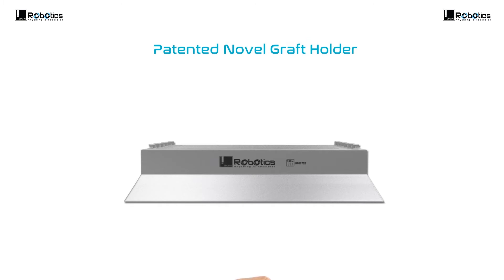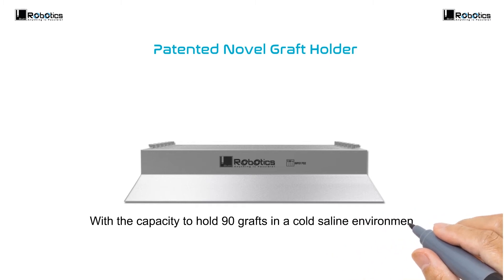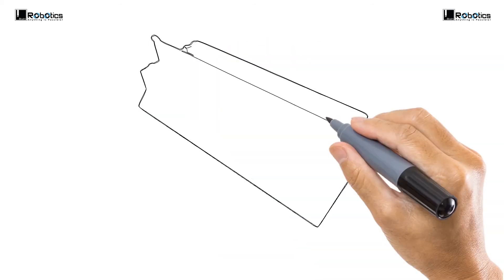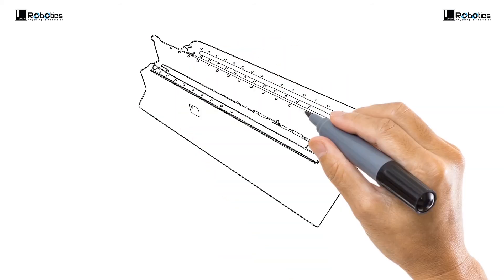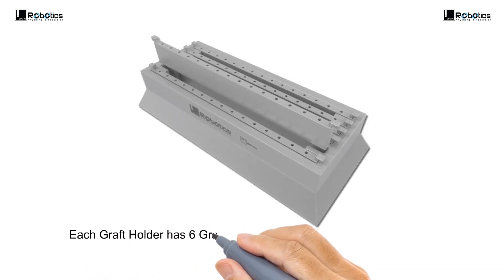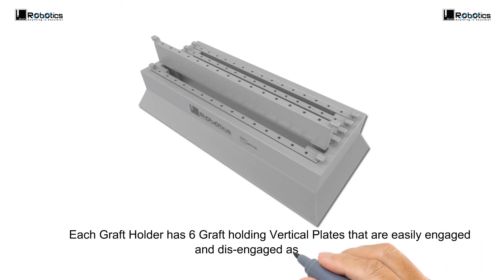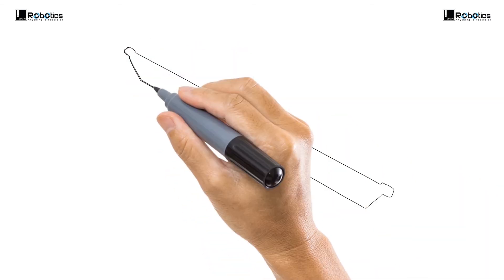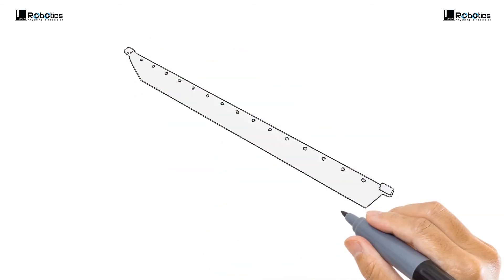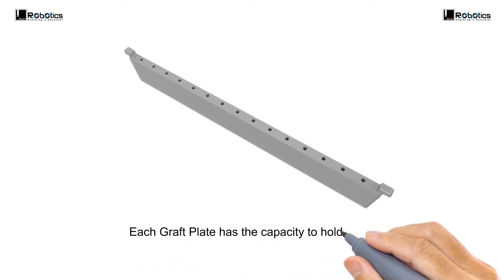Patented novel graft holder with the capacity to hold 90 grafts in a cold saline environment. Each graft holder has 6 graft-holding vertical plates that are easily engaged and disengaged as required. Each graft plate has the capacity to hold 15 grafts.